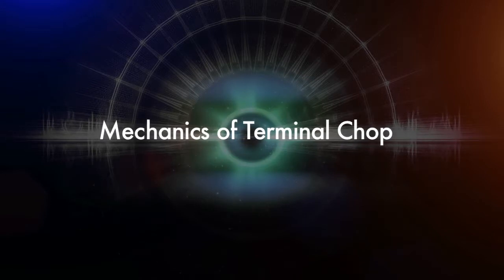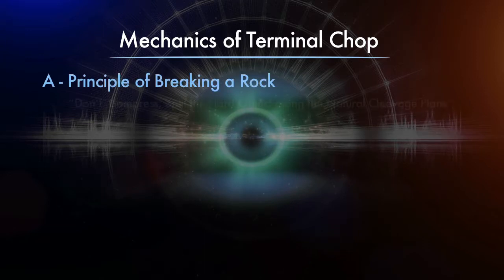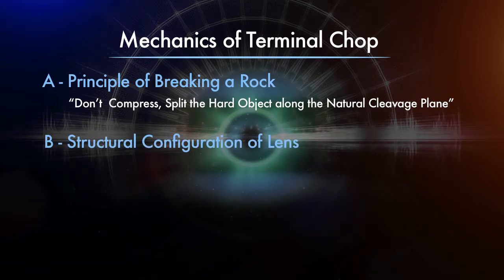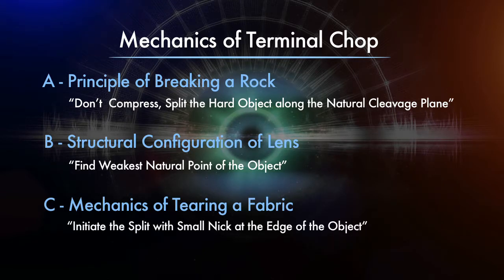The unique mechanics utilized in terminal chop is based on and makes full use of: A. The principle of breaking a rock. Don't compress, split the hard object along the natural cleavage plane. B. Structural configuration of the lens with unique anatomical arrangement of lens fibers. Find the weakest natural point of the object. C. Mechanics of tearing a fabric. Initiate the split with a small nick at the edge of the object.